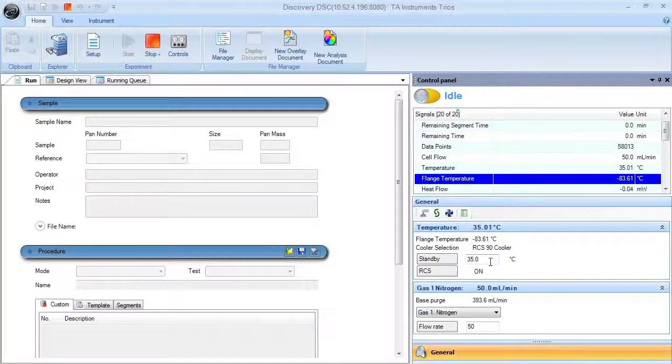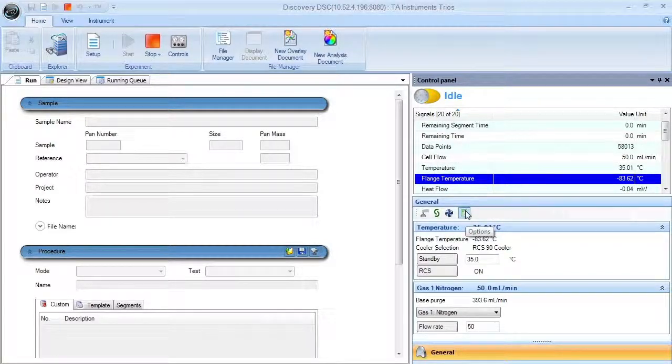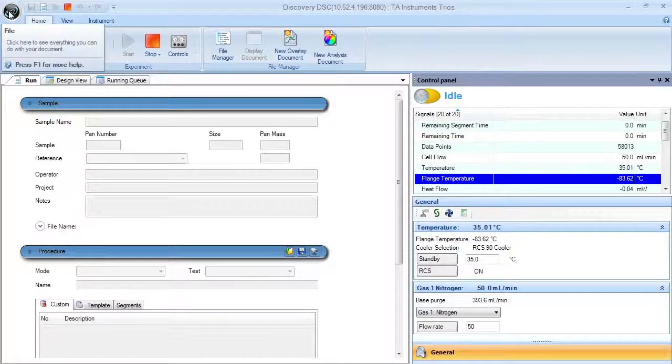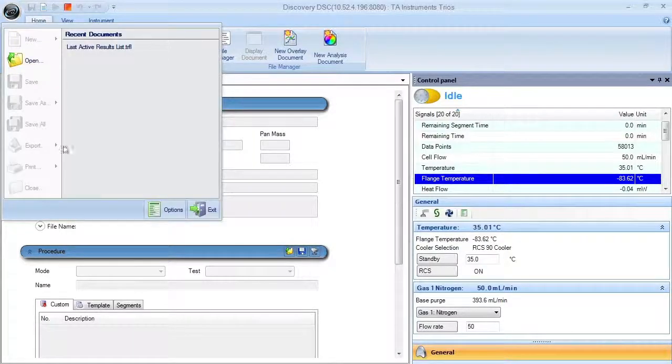From the control panel, you can then launch the options window. This can also be accessed through the TA bubble.